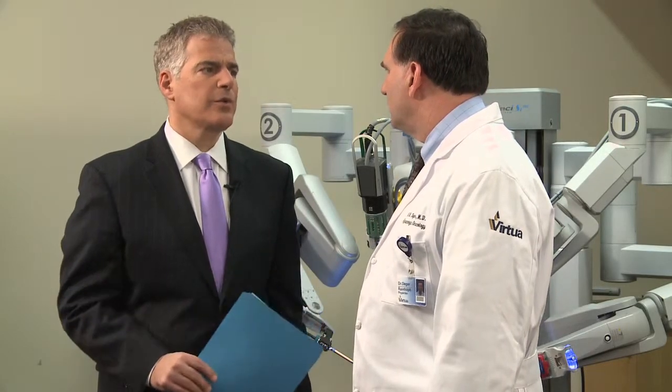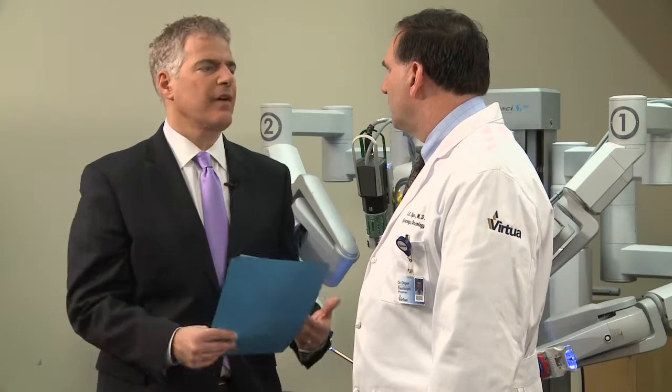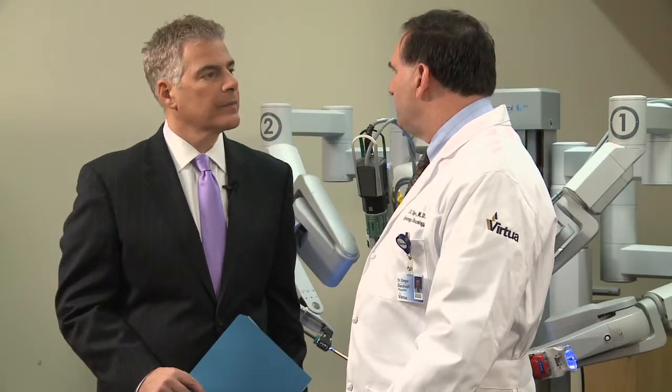Do most patients respond well to the idea of this robotic surgery, or how much educating of them is involved in the process? The majority of patients are delighted with the recommendation. Once in a while, a cancer patient will be concerned with the inability of the surgeon to get their hand in the abdomen to feel all around to be sure there is no other cancer. That's a rare circumstance, and if you choose your patients correctly, you almost invariably will not be in that situation.